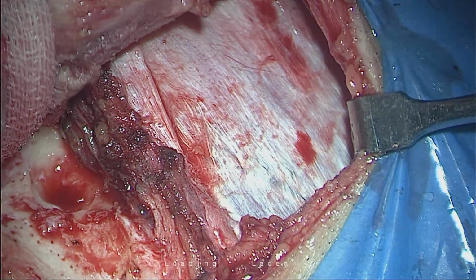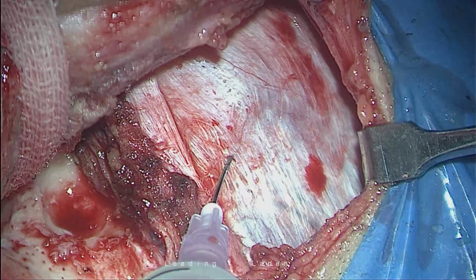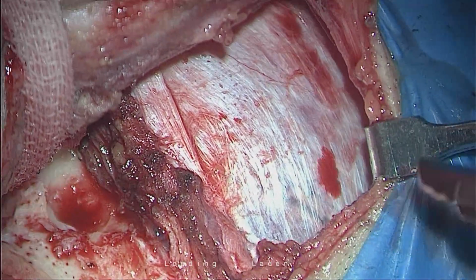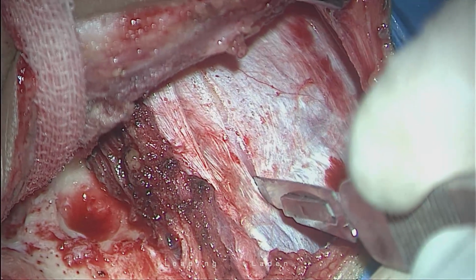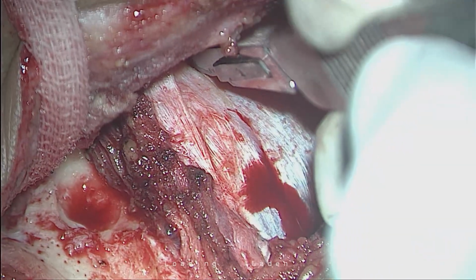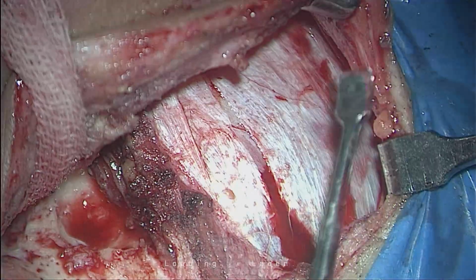So our goal is not to take the innominate fascia, not to take muscle or any additional tissue, because this graft is going to be a free graft. This is not a vascularized graft. It has to sustain its metabolism unless it is vascularized. So it has been believed, we all know, that fascia has minimal metabolic requirement. So I am harvesting the true temporalis fascia graft. This is what we always propose.